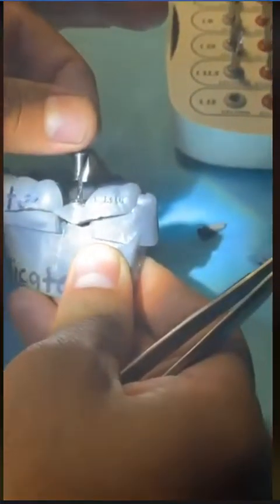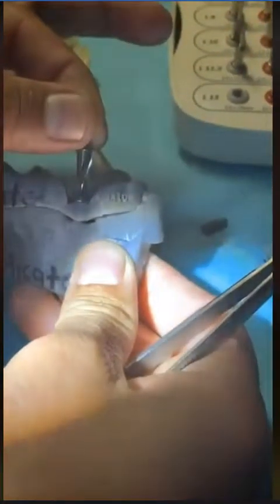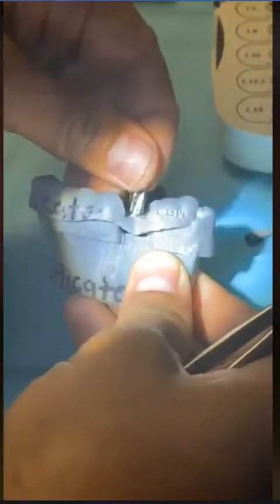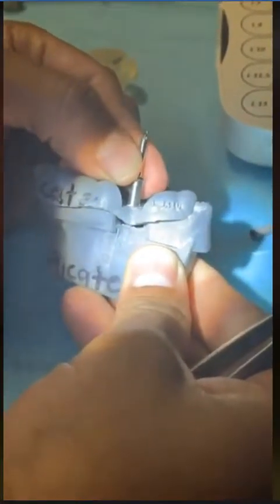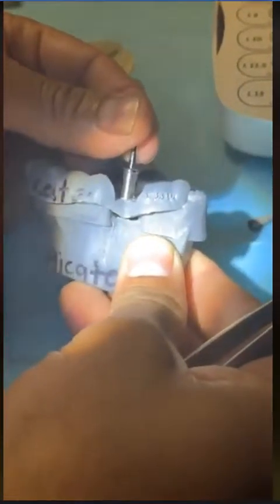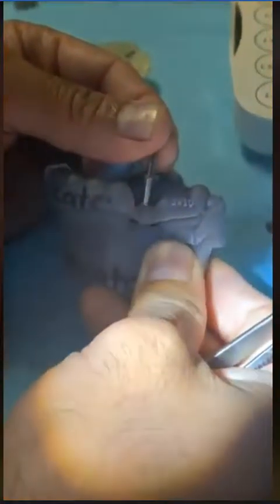So that's why the 2 millimeter pilot by 13 millimeter guide is not going to be a good idea. So what do we do? Let's take a 6 millimeter burr, okay, and we go with the 6. Now take a look. Even with the 6, I'm able to engage into that tube. That means immediately I am benefiting from my guide by simply putting in a 6 millimeter, okay?